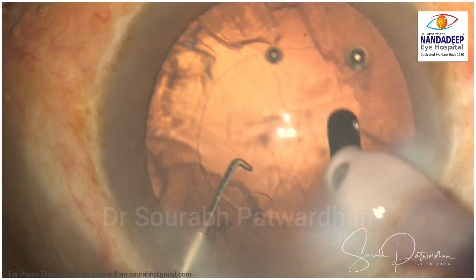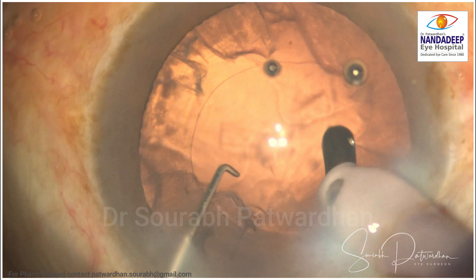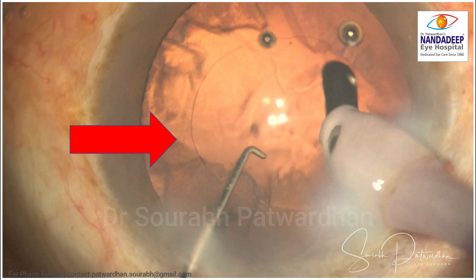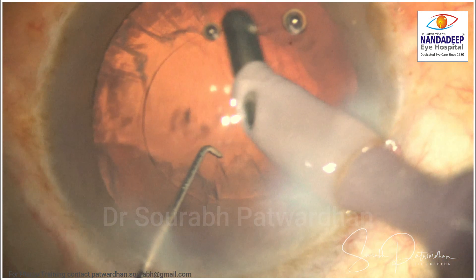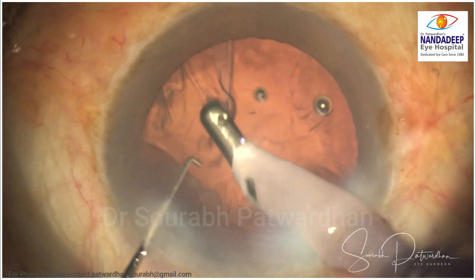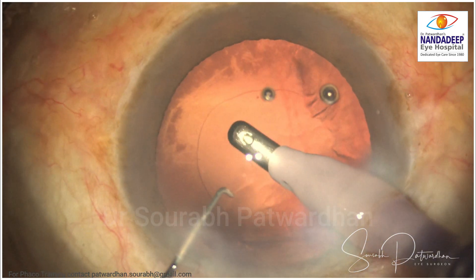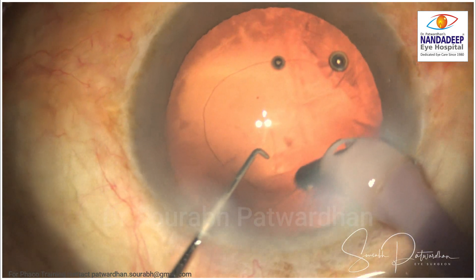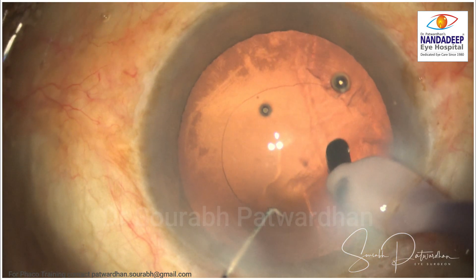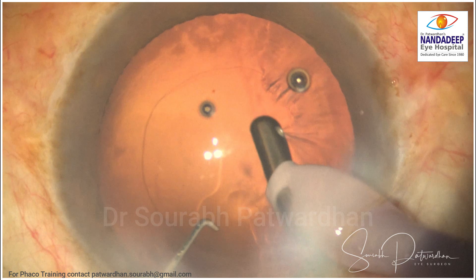This is a very subtle sign. When I try to remove this cortex the anterior capsular ring on the other side starts fluctuating because of the fluid going there — but you don't find this in normal cases. So there might be some anterior zonular weakness or laxity here. In these cases, when you are close to the anterior capsule while removing the cortex, the anterior capsule may try to go into the aspiration port, so you have to be very watchful. Just watch closely — whenever I try to go near the anterior capsular rim, the rim itself tries to get engaged in the aspiration port.